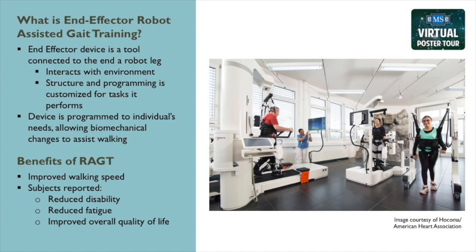The robotic ankle is programmed to mimic these movements of the ankle during these gait cycles, which in turn provides biomechanical advantage for the knees and hip to activate accordingly. So basically, when you achieve that end effector change, it makes biomechanical changes in the knees and the hip and helps the person to learn walking.